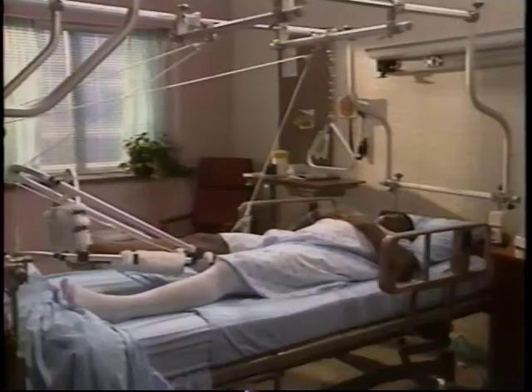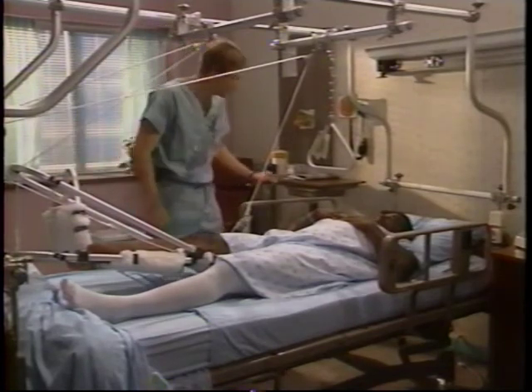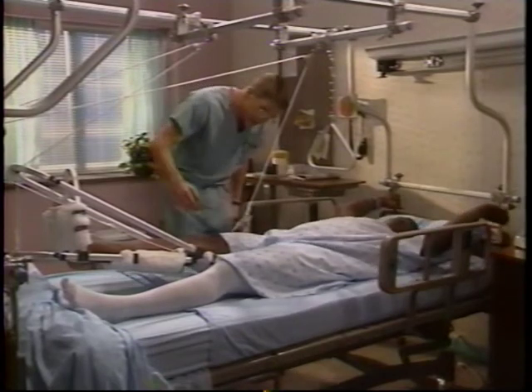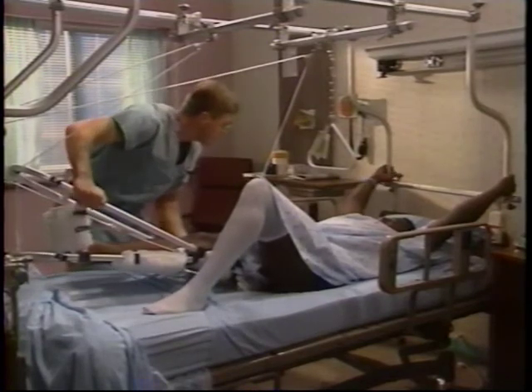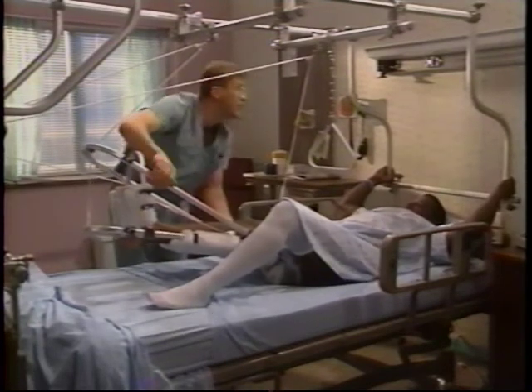When moving the patient up in bed, do not tug or jerk the patient against the traction. Make sure the weights and ropes are free of any entanglements. Have the patient reach behind and use the traction frame to pull themselves up in bed. Assist by easing the splint, but not the weights. Easing the weights releases the traction.